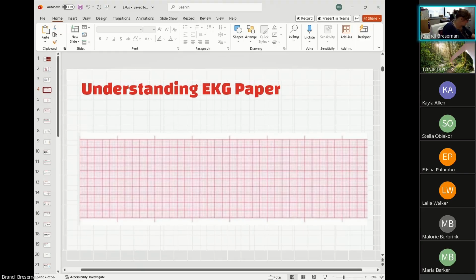using a tool called, what did I do with it? I know I brought it. Oh, there it is. We would use a tool called calipers. Has anybody heard that before or know what calipers are? Nowadays, everything's electronic on monitors, but I will show you. I'm going to show you something funny. These are very beat up, but these are my original calipers from nursing school.